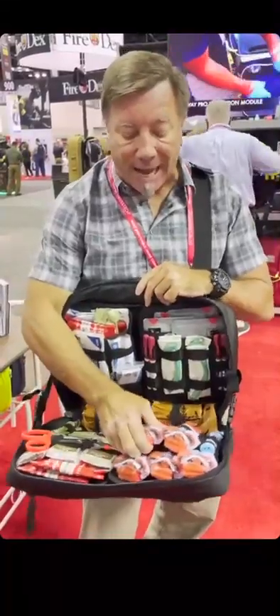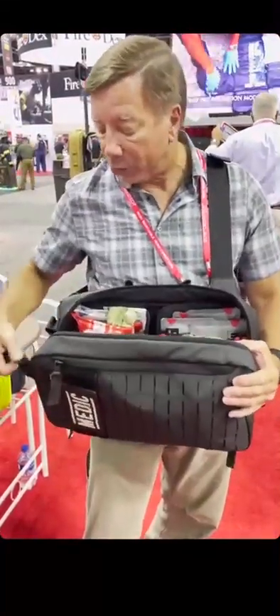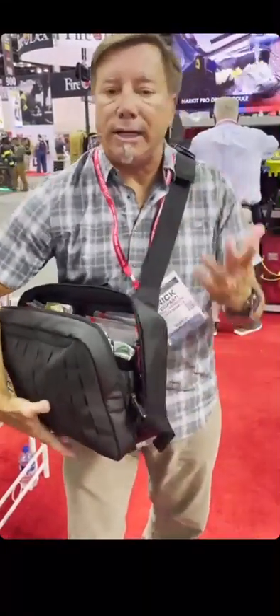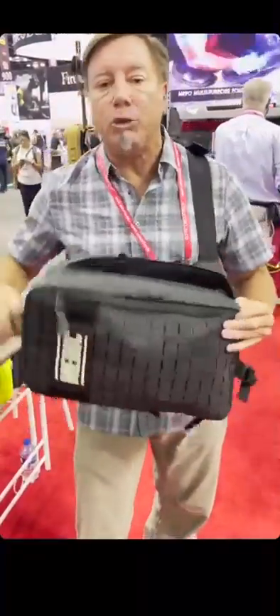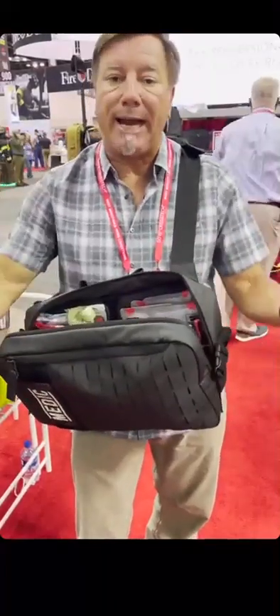You can easily access any of this — that's the design of the sling pack. The reason we do this as a sling pack is because, unlike a backpack, I don't have to drop it off me to get access to things. I can easily spin it around, access it, and work a patient. If I need to move, I can easily pull the zippers up and move.